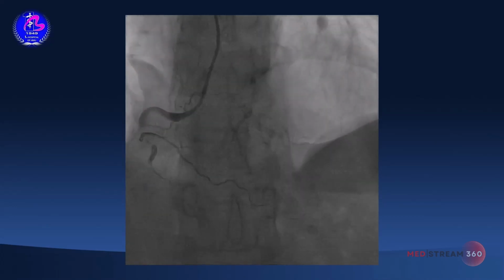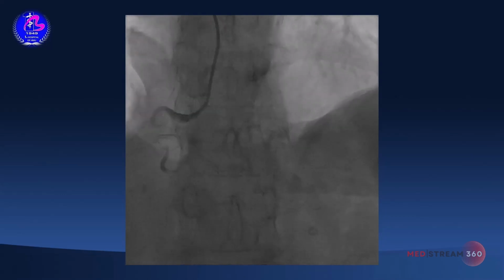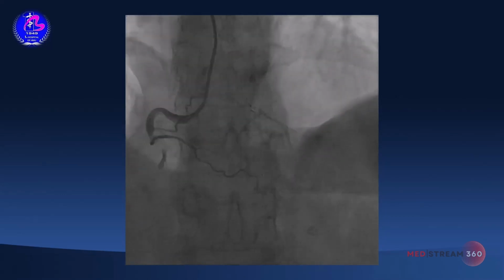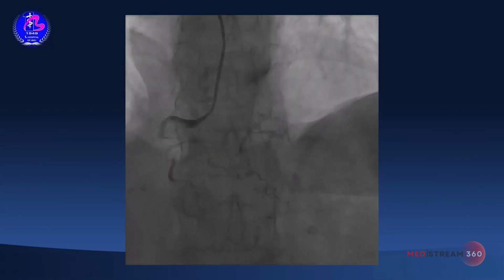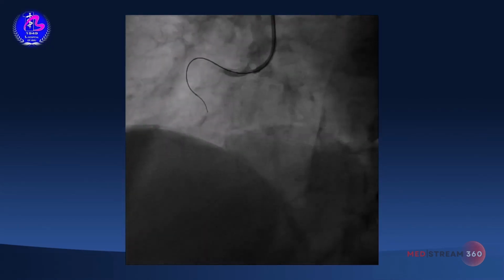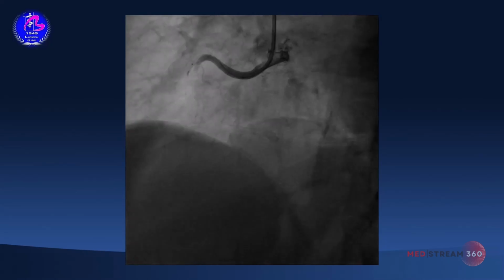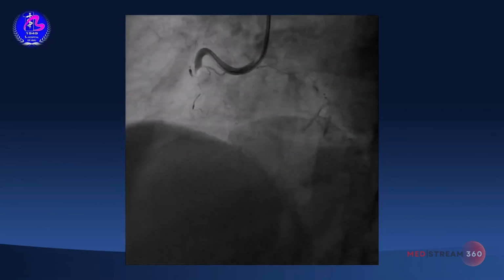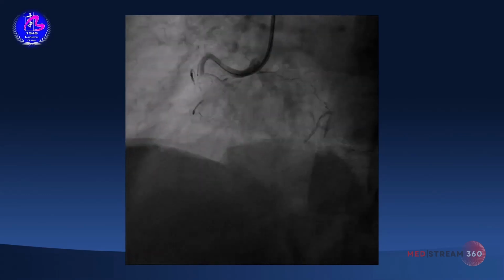Hello, everyone. Just now, Dr. Jing already introduced the baseline information of this patient. As we know, this patient has an RCA proximal middle portion total occlusion, with a blunt stump, and with a side branch at the ostium of the proximal cap.